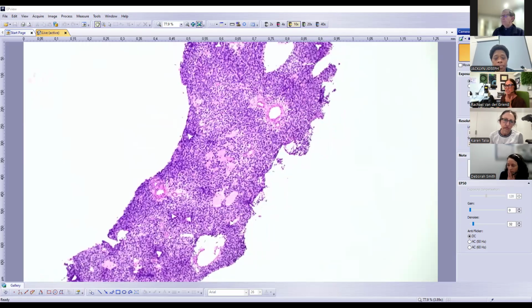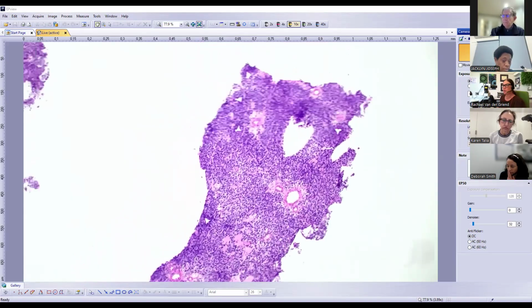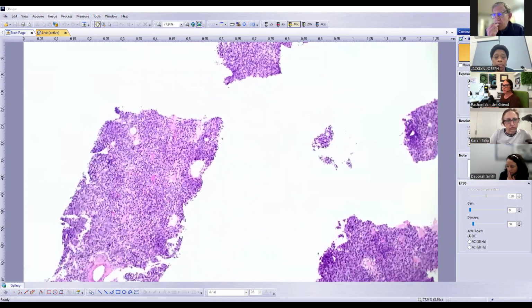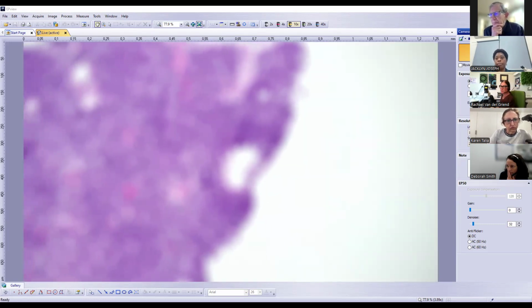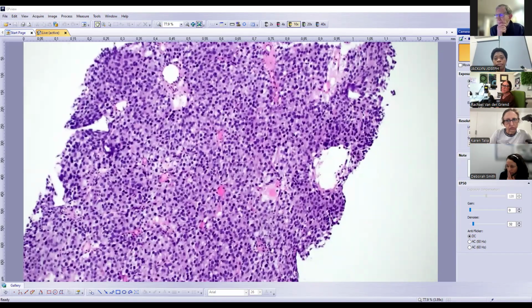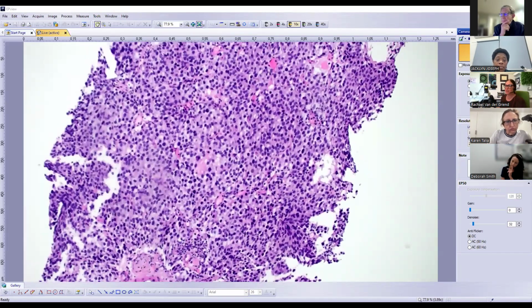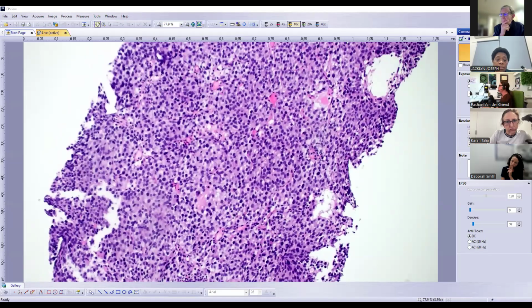The other interesting thing is she's got a serum HCG, which is just very slightly elevated, and she's not pregnant, and she has quite a high AFP, like in the hundreds. And we got these cores of tissue, quite nice cores. They all look the same. So I'll just randomly focus on one of them. And this, I think, is quite helpful with that article of Karen's, because this one's really just quite monotonous and solid. There's a vaguely nested architecture in some of the cores.